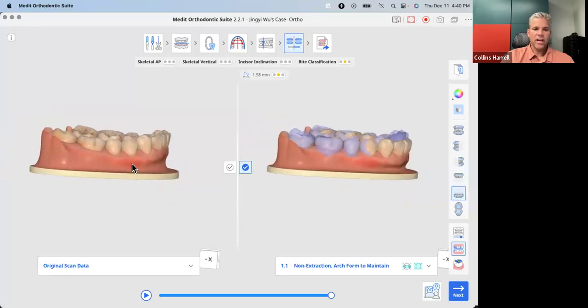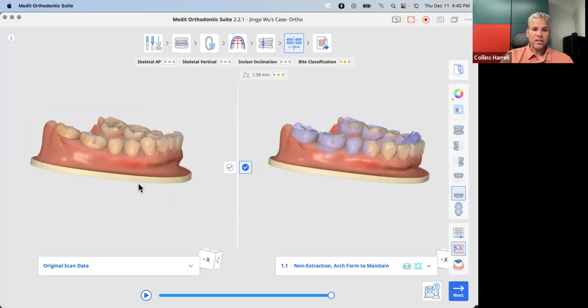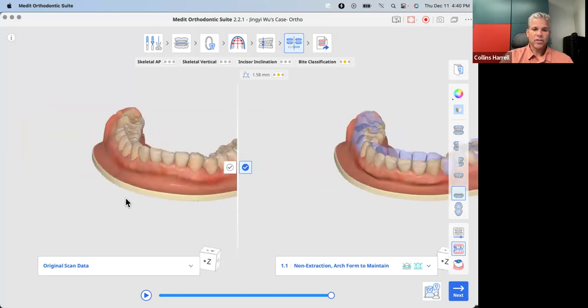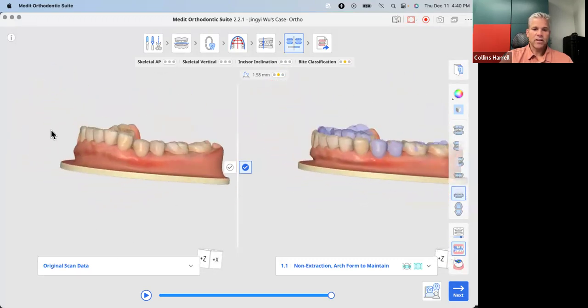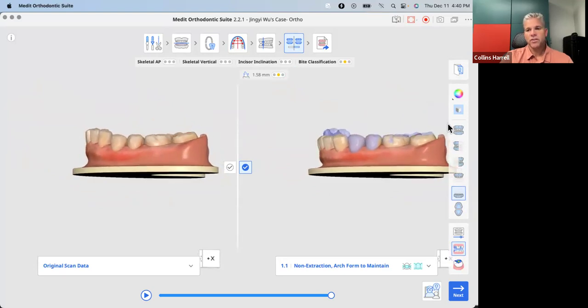If the patient's not up for that and you want to try it all with aligners, we certainly have seen over and over that you're going to improve this curve of Spee with aligners only, but she has pretty small clinical teeth, pretty short clinical crowns, and dense bone. So it's going to be a little bit slower going with an aligner start on this one.